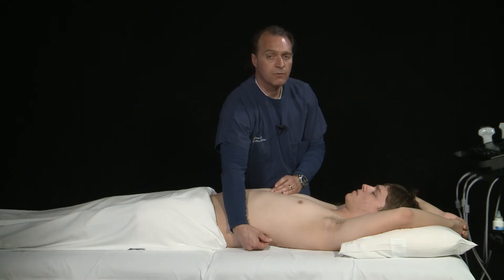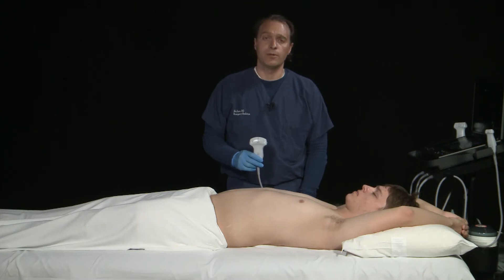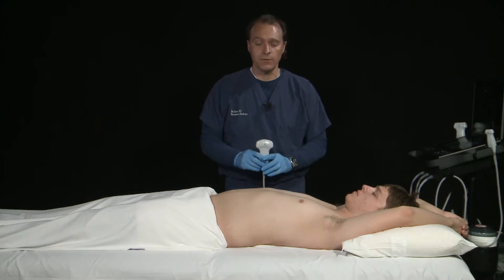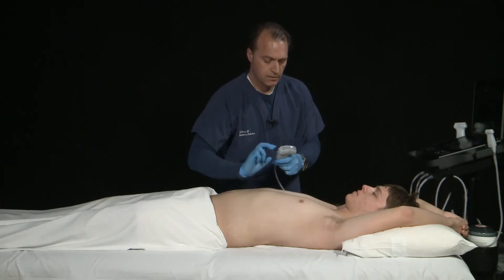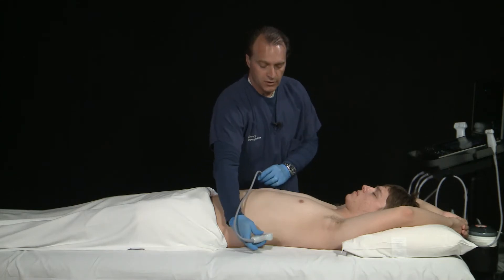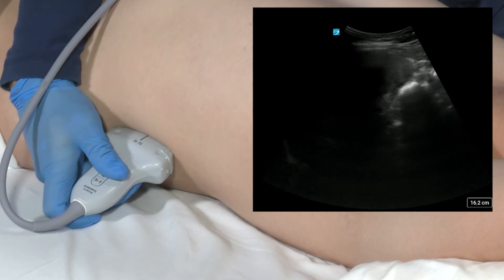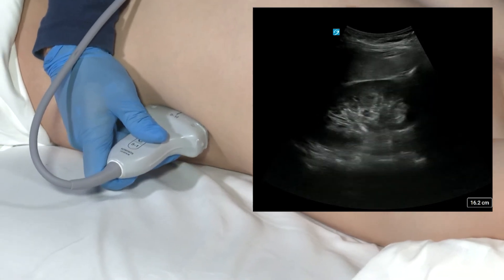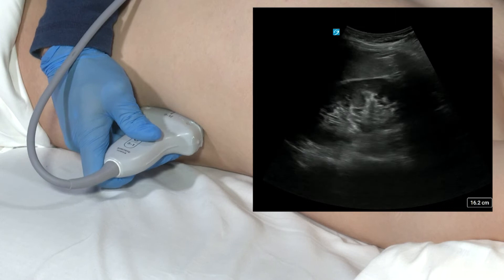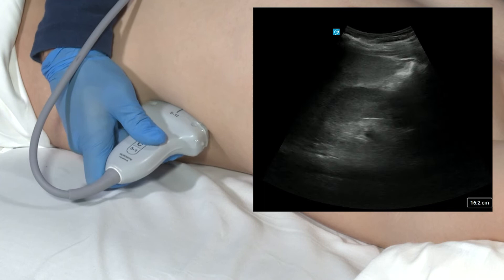The marker dot as we start off will be pointed towards the patient's head. When imaging the left kidney, we will again use a curvilinear transducer. We're going to start off in the long axis view by finding the xiphoid process and drawing an imaginary line all the way to the posterior axillary line. Our hand is actually going to be resting on the bed as we perform this exam. As we look to obtain the image, we will find both the spleen and the kidney. We will focus on the kidney and may need to rotate the transducer in between the ribs to improve our view.